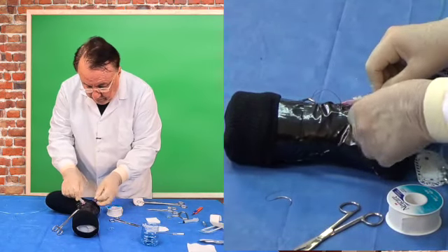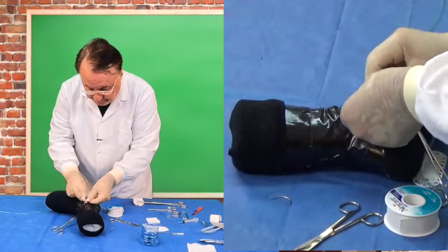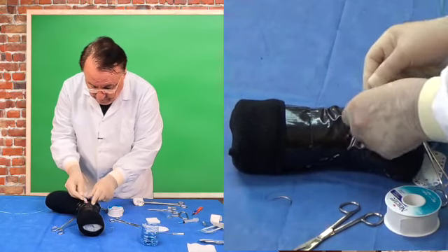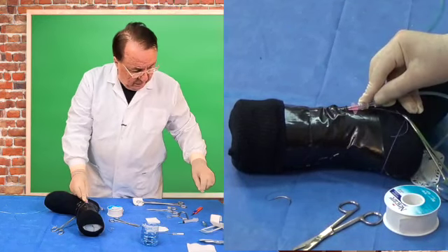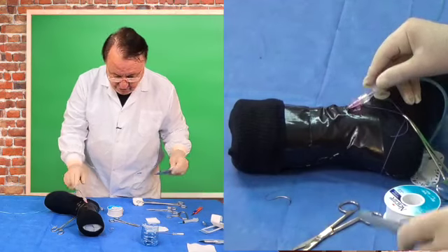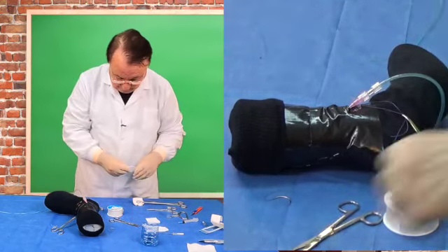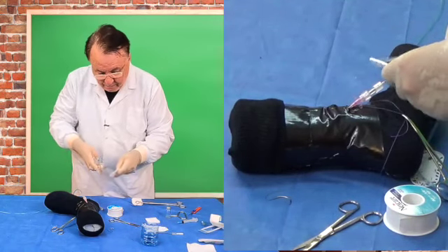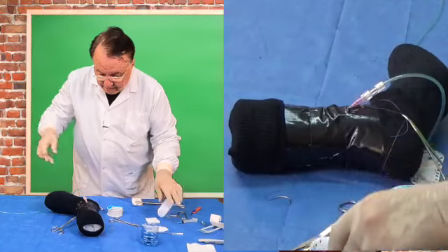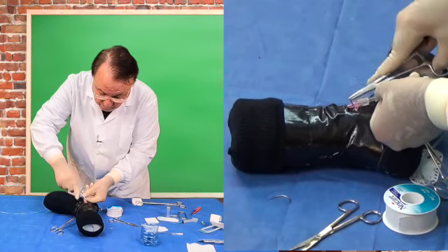I want to be careful that I don't lose the site. If I have an assistant, I'll have them hold it. Otherwise, I will just get another suture and take my needle holder and suture it in place.